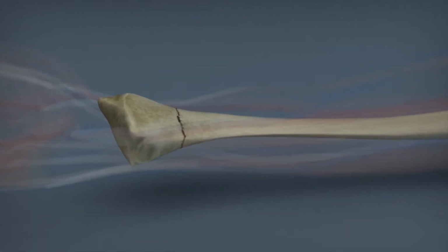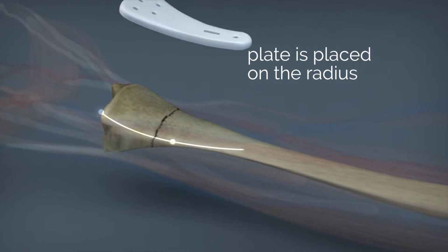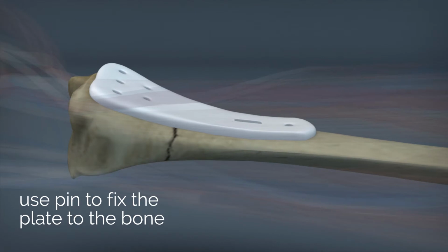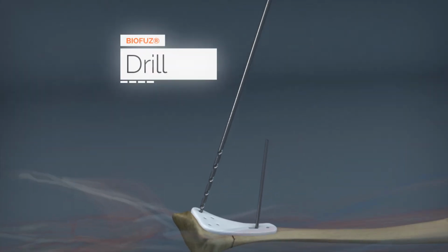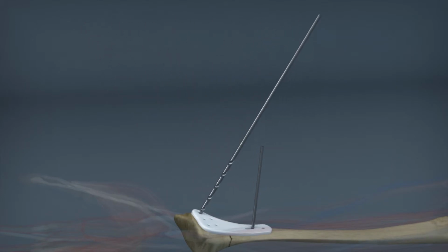Prepare the surgical site as usual. Put the plate in the adequate position. First, it could be helpful to lock the plate to the bone. To achieve this, insert the pin into the proximal hole. Drill is placed onto a pilot hole. Drill can be oriented in 360 and in any axis.